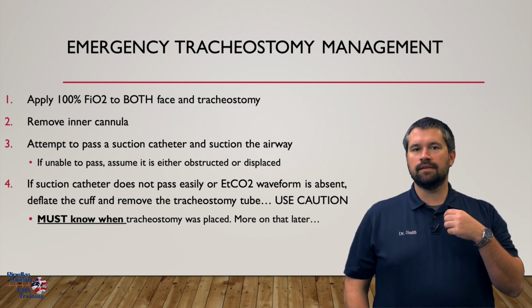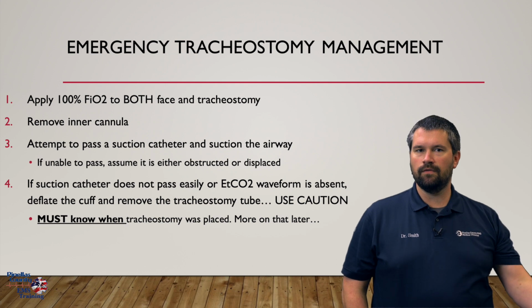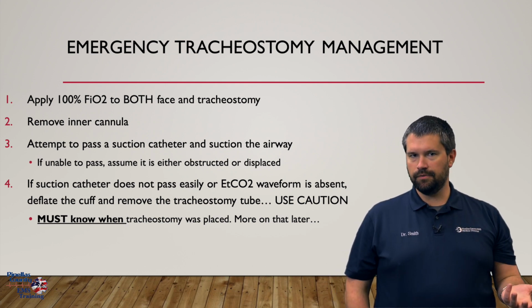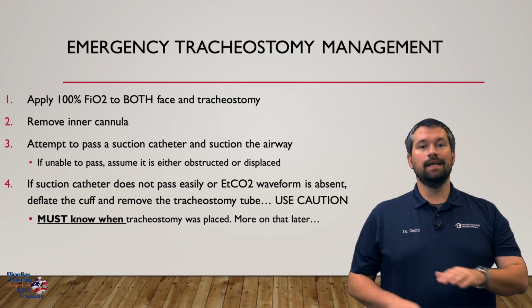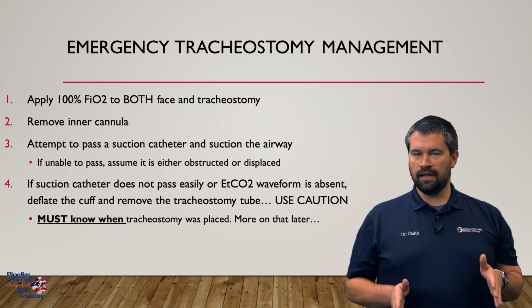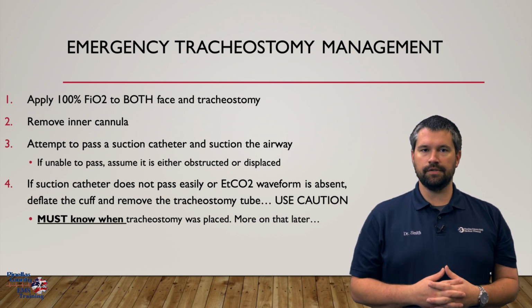If you cannot pass a suction catheter easily, or if the end-tidal waveform is low or absent, deflate the cuff and remove the tracheostomy tube. Use caution here. You must know when the tracheostomy was placed. This is critical, and we'll talk about that a little bit more later, in a very dangerous complication.